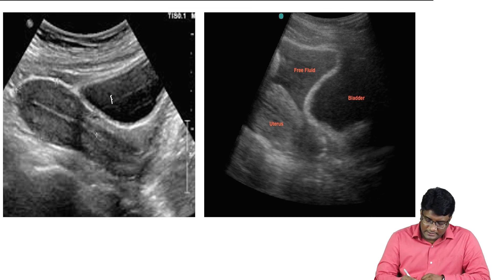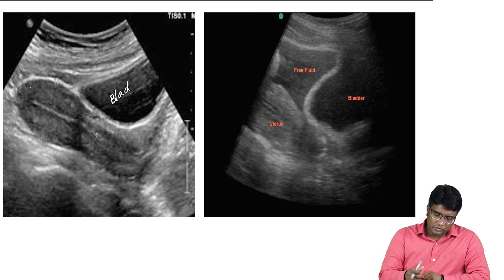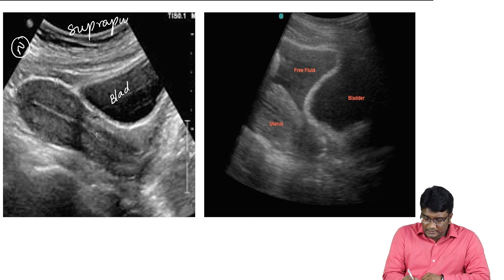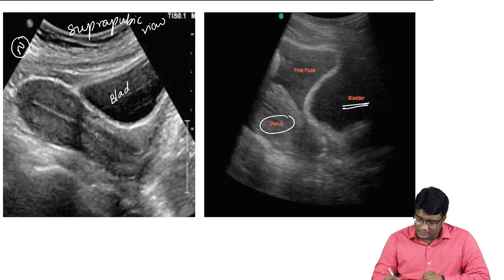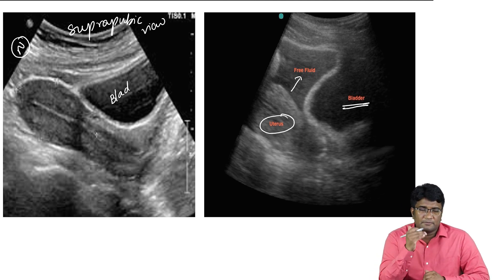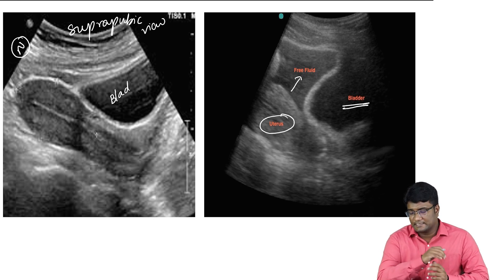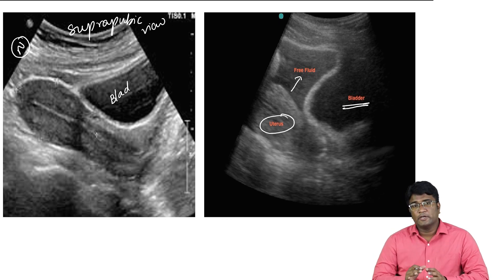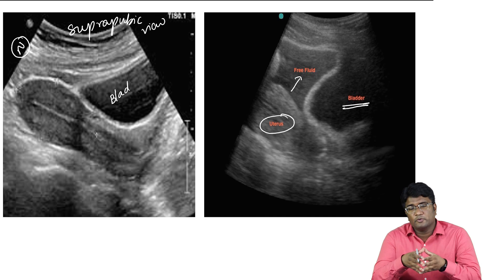On the pelvic view, you can see the bladder as a hypoechoic area and the uterus in female patients. A normal suprapubic view shows no collection. If there is a pelvic hematoma or collection, a hypoechoic collection is visible between the bladder and uterus, indicating free fluid. FAST is done in the emergency by an emergency physician, not a radiologist. You should know how to perform it as well as how to interpret it.